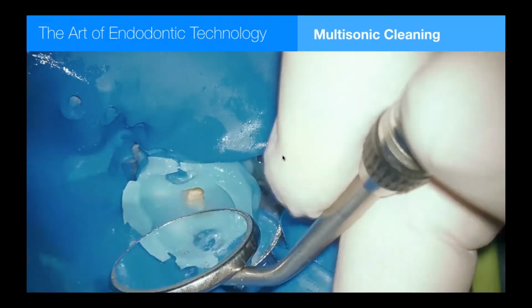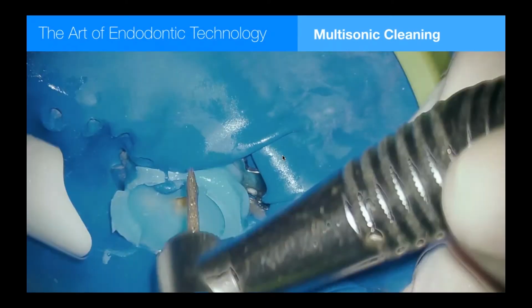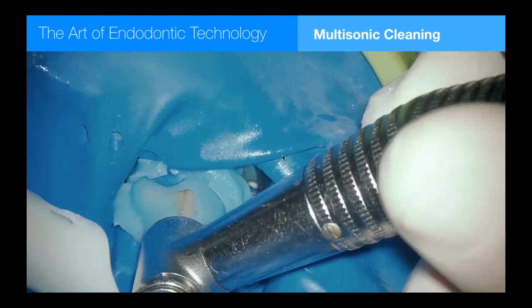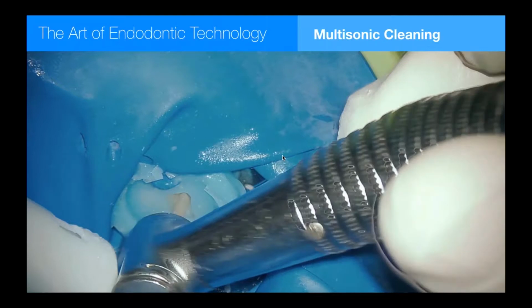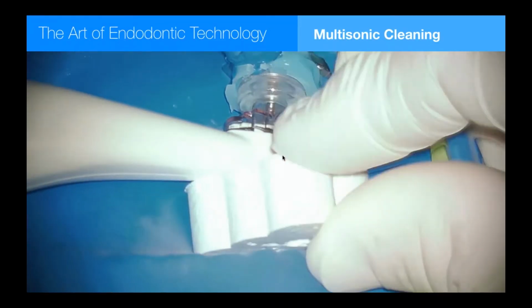That right there, there's a thin layer there. We've got to cut that off. So just angle your burr, make sure you hit the cavo surface, and get a little butt joint right there. It'll make it harder for the solutions to sneak underneath the seal. Take that off, and I'm ready to put the procedure instrument on.